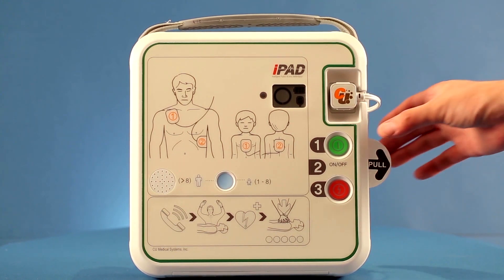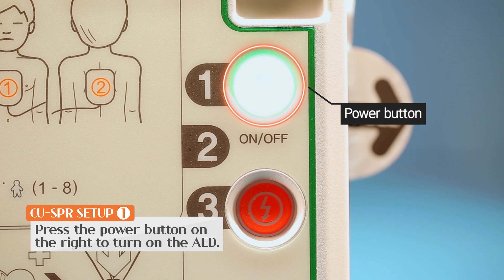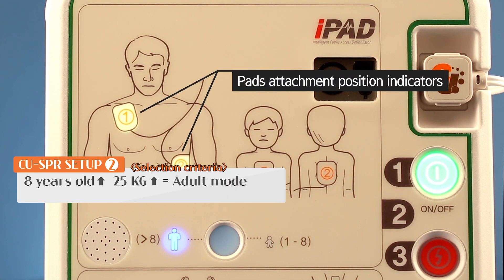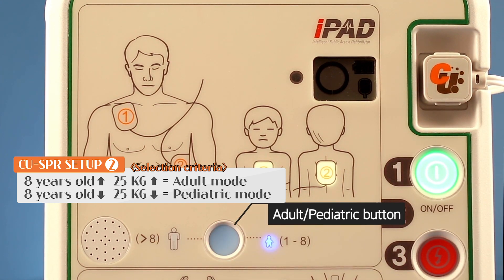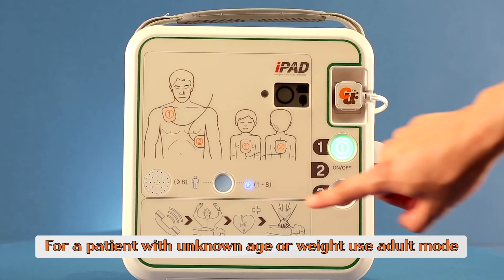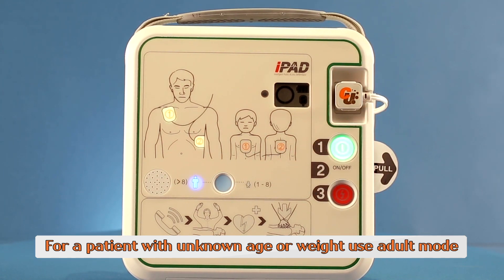Now, turn on the AED by pressing the power button. Adult mode is set as the default mode. For patients aged 8 years or younger, or those who weigh less than 25 kilograms, shift the unit to child mode by pushing the button. If you are unsure of the weight and age of the patient, proceed to treat them in adult mode instead of delaying treatment.